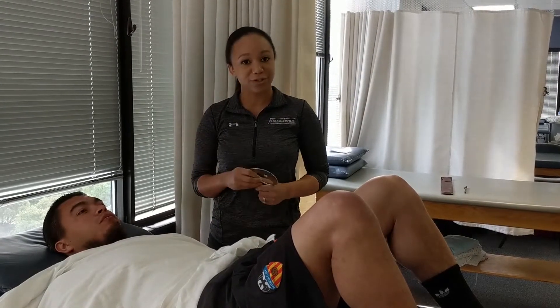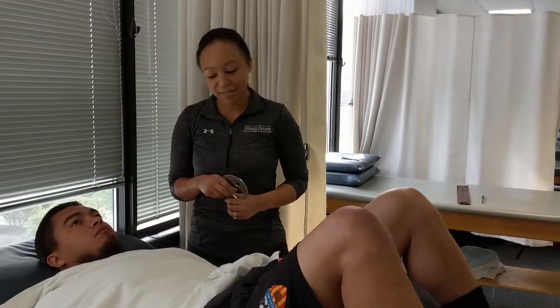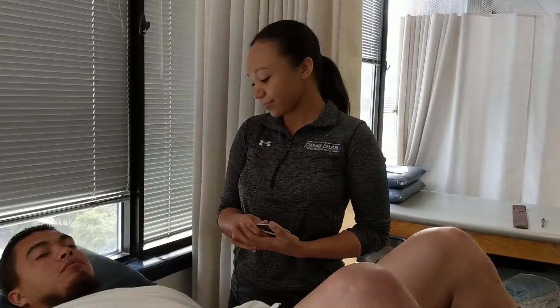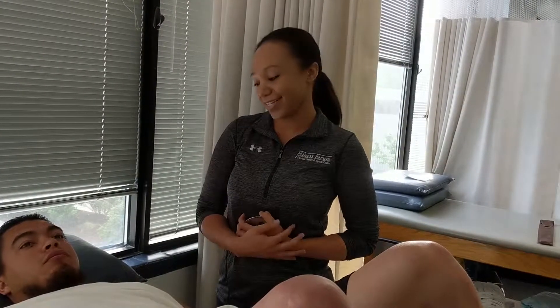There are a few different tools that you can use for soft tissue mobilization with instrument assistance. So this is Jimmy, our patient. I'm going to show a few things on the shoulder that you can do. Typically with instrument assisted soft tissue mobilization, you can use it for pain and for neural input. You might see the patient have an increase in mobility — they'll think they're getting strength gains, but it's that neural input you're providing with the instrument. You want to be careful to properly assess the patient before you start. Make sure there's no open wounds, no active infection, the patient has consented, and that they have proper sensation. You never want to damage the skin — you should never notice bruising. You usually use the tool until you see a nice pink or warm response.